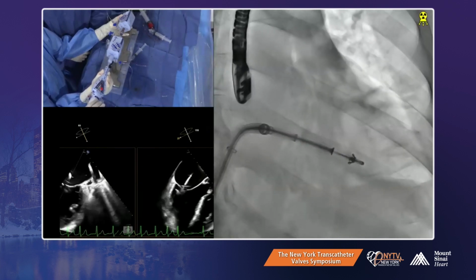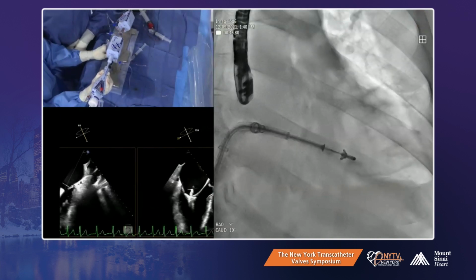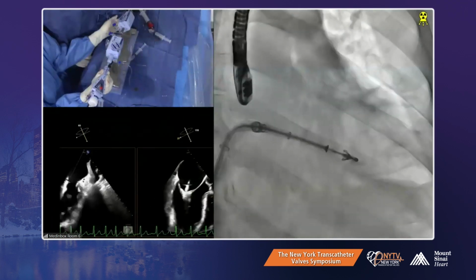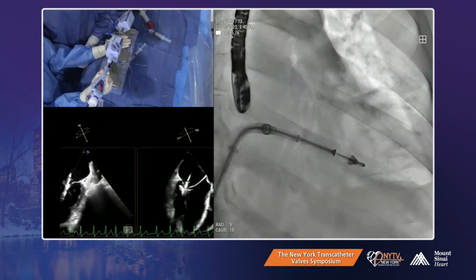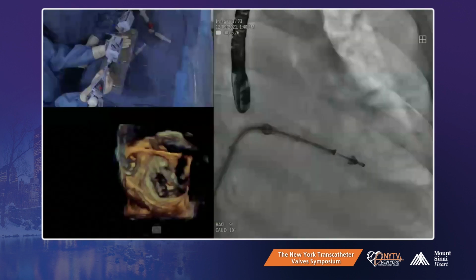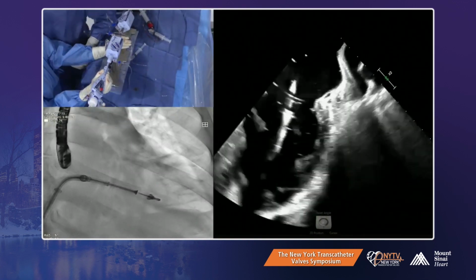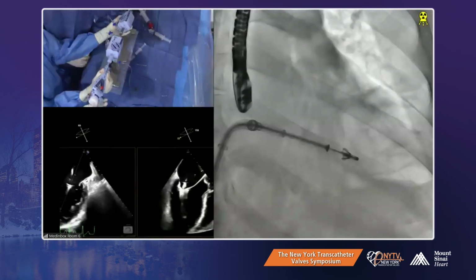Do me a favor, do a 3D here. No, it's okay. You can see a shoulder on the leaflet. 3D, please. Yeah. That's it, brother. It's good. Okay, pretty good. Okay, 2D. Yep. Every time 3D is saying the orientation is good.